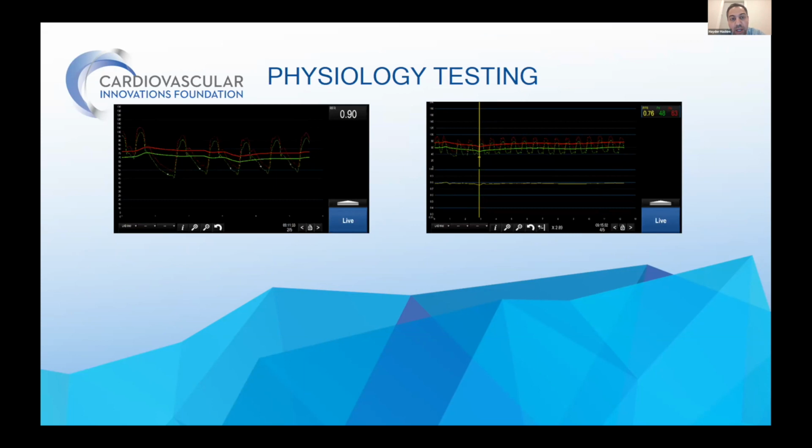Now, have I done this in borderline physiology? I'll let Abdul talk about physiology, and probably he will answer this question. In borderline resting non-hyperemic indices, when I do the measurements, if it's 0.90 and I put that in the clinical context, I do believe that if you induce hyperemia, you can provoke more distinctive values for you to make an easier decision.